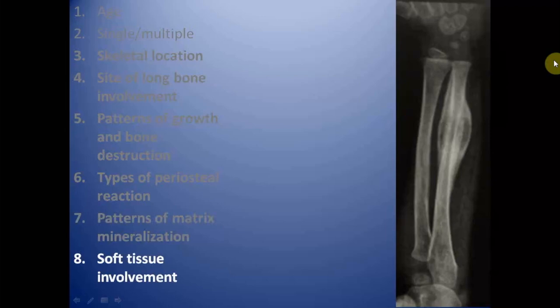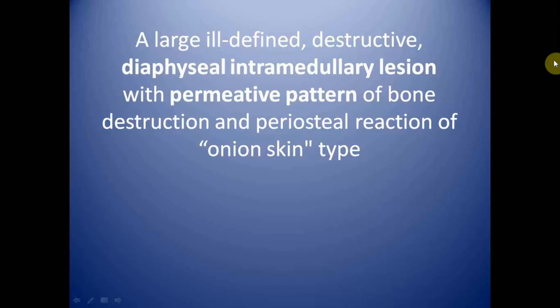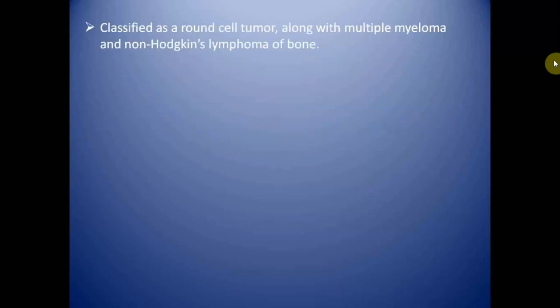This is the case of a large ill-defined destructive diaphyseal intramedullary lesion with permeative pattern of bone destruction and onion skin type periosteal reaction. This is the case of Ewing sarcoma. Ewing sarcomas are classified as a round cell tumor, along with multiple myeloma and non-Hodgkin's lymphoma of bone.